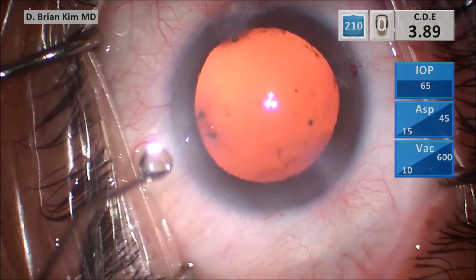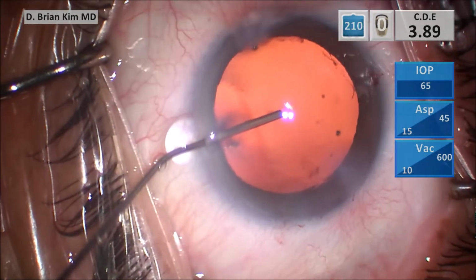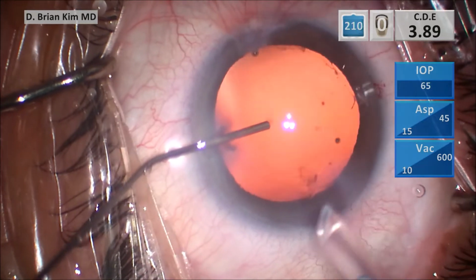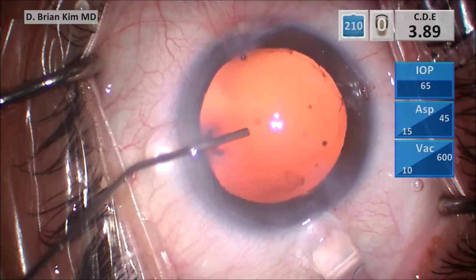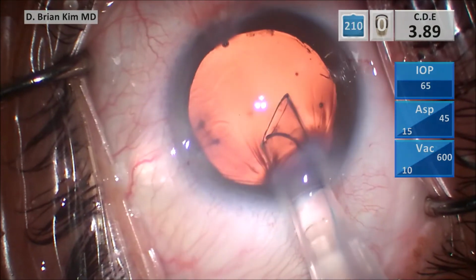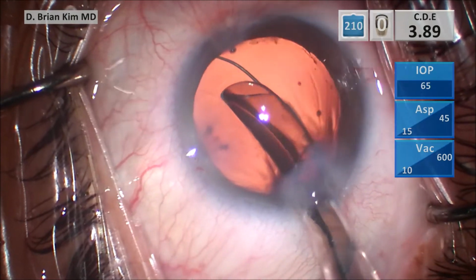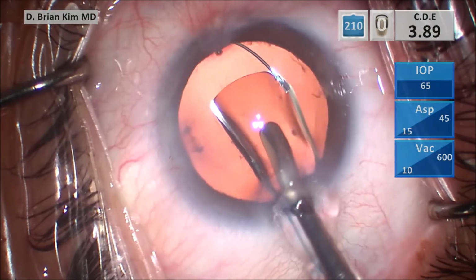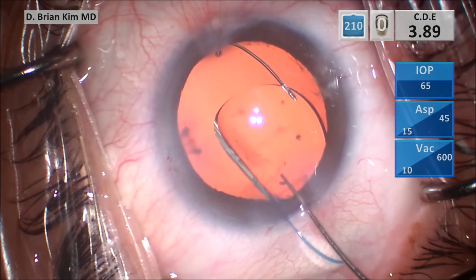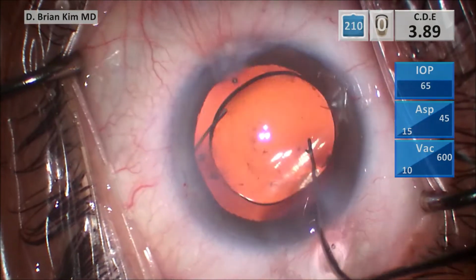So again, filling the capsular bag with more cohesive viscoelastic, holding the eye still, going in, bevel down, making sure I get in nice and easy here. Turning the bevel to the left, deliver the leading haptic into the bag. The optic opens up, rotate my hand counterclockwise so the optic comes out flat. Using the Multiman to dial the trailing haptic into the bag, rotating the lens.